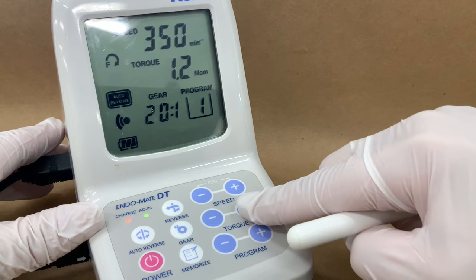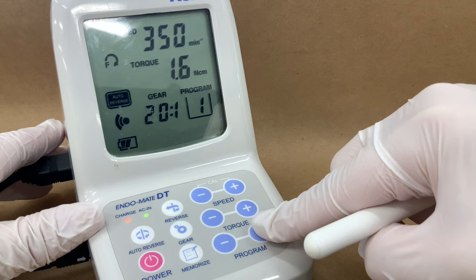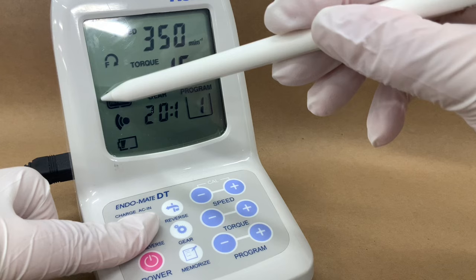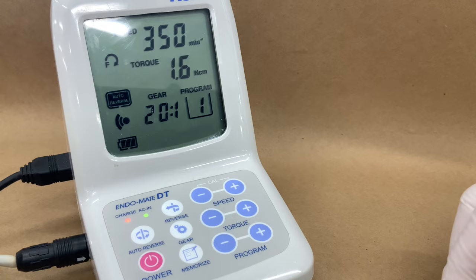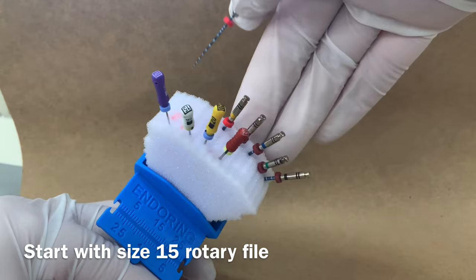Adjust the speed to 350 and torque to 1.6. The auto-reverse function should be on with the bracket around the icon. This is a built-in safety measure. When the unit reaches a given torque, it will automatically stop and auto-reverse out of the canal, disengaging the file from the dentin.